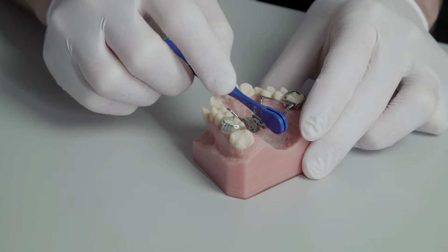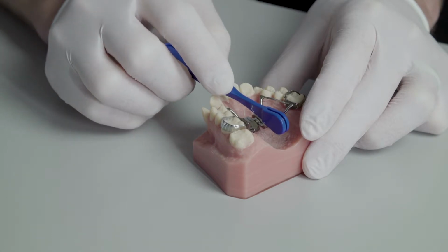When removing the key, be sure to remove the key towards the back of the mouth so that you don't reverse the turn that you just completed.